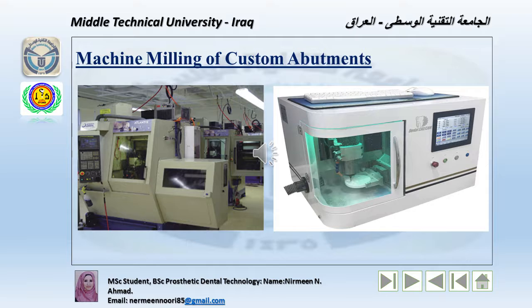Custom abutments are milled from a titanium or ceramic rod once the virtual design of the abutment is completed. The digital abutment file guides the cutting tool of the milling machine in 6 degrees of freedom, so the different abutment materials are manufactured into the finished custom abutment. Milling machines range in size, rate of abutment production, and cutting degrees of freedom.